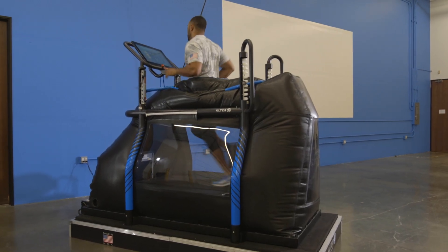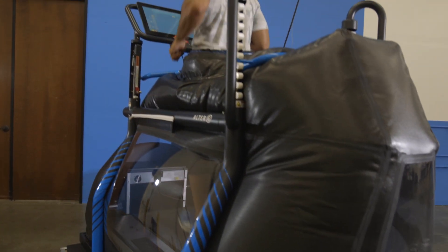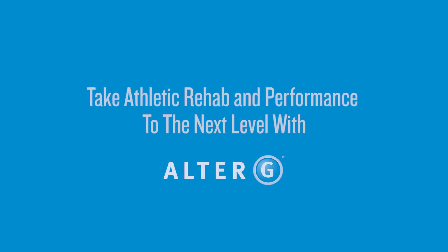No matter where your rehab and training journey takes you, let the AlterG Pro 500 anti-gravity treadmill lead the way. Contact AlterG today to learn how to make the most of the most precise unweighting technology and powerful, industry-defining analytics.